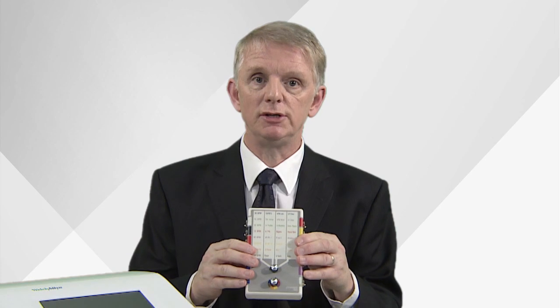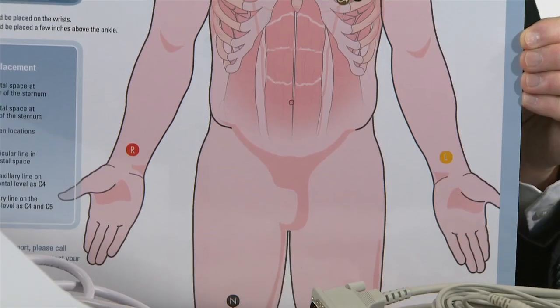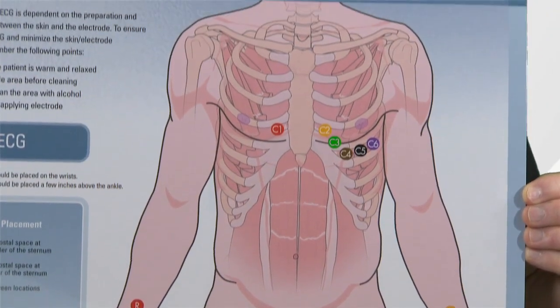Today for the purposes of this ECG I'm going to be using a patient simulator. If you need help or advice on ECG preparation or lead placement, the unit also comes with a full colour poster giving useful tips on both.